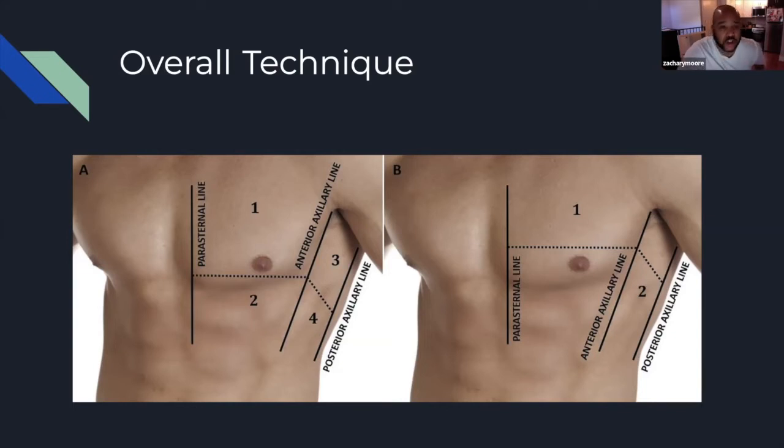And then of course, you're going to start anterior cranially, meaning on the most anterior, and kind of like mowing the lawn, you go down and then you go to the axillary and then you go to the posterior and so forth. And you have to think about all the pathological non-aerated areas as well, which allow for deeper penetration. These could be pleural effusions, pulmonary consolidations, infarctions, even a lung collapse or a lung tumor. And you have to determine where the abnormality lies, if it's in the pleural space, or whether it's actually within the lung itself.